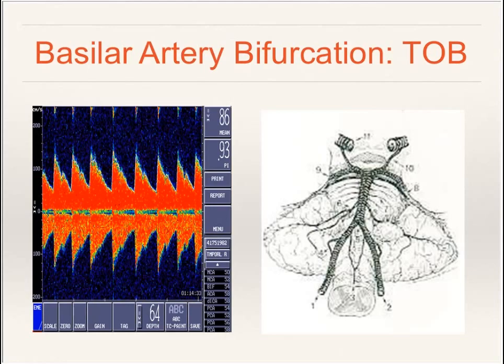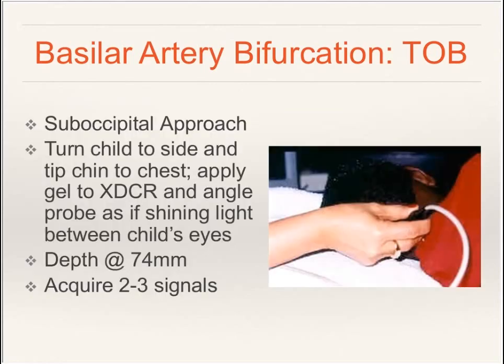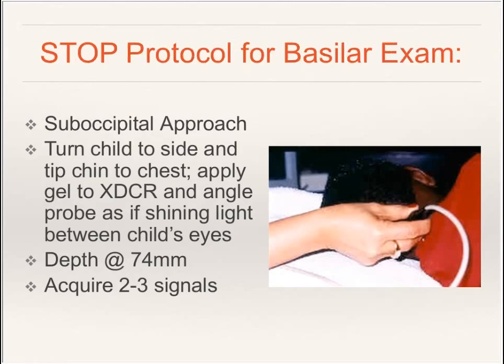So it's also known as the basilar artery bifurcation, or the top of the basilar, where you would get this bidirectional signal as well. All of this is being acquired from the temporal approach. Now we will also look at the vertebral basilar system, but very briefly.